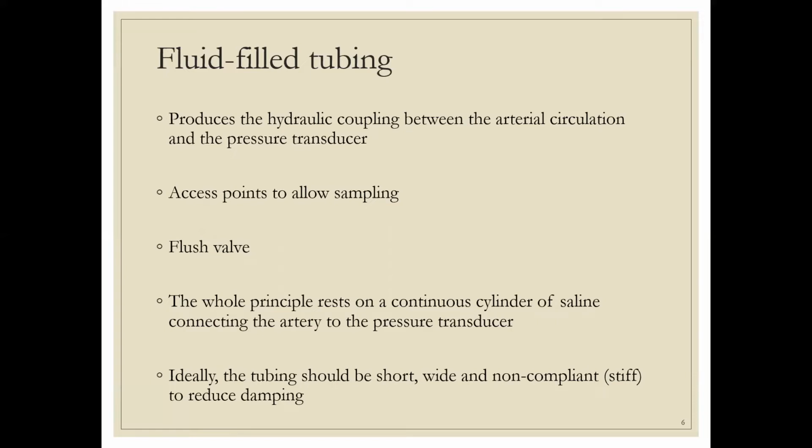Usually, the system comes with a fixed length, and much variation in the length should not be done. These fluid-filled tubing also has various sampling ports through which we can draw samples, and we can also flush the system. And what this tubing does is it provides continuity to the system.